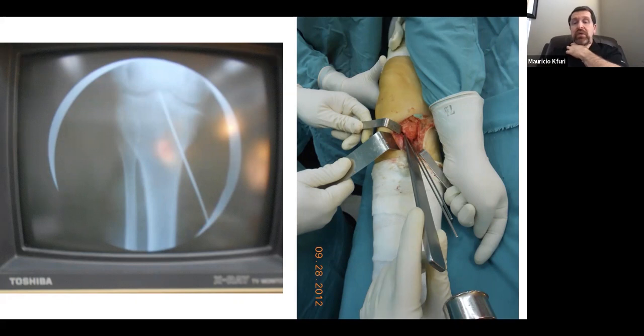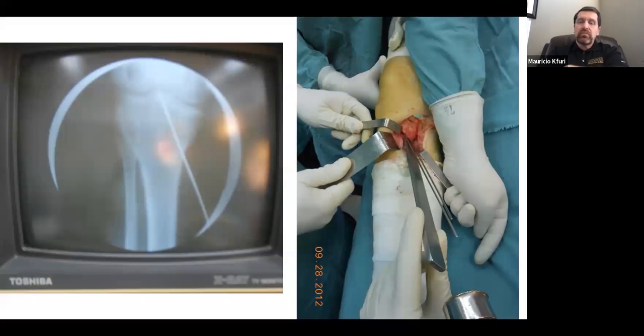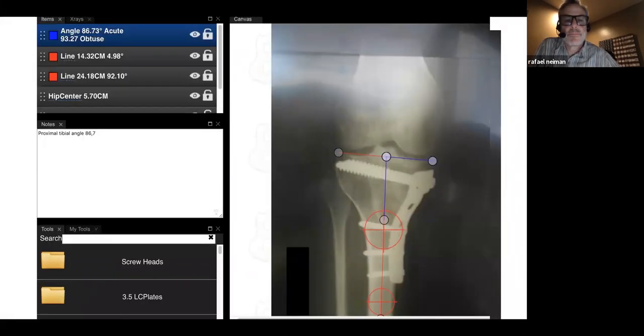Sometimes they have to peel off the MCL from the bone, even if you don't cause any kind of tear to the MCL. Right. You have to lift it. Otherwise, you're going to cut over the MCL. Yeah, his wires enter at the distal end of it, so that's probably intentional on his part to keep the osteotomy so distal to start. Mm-hmm.